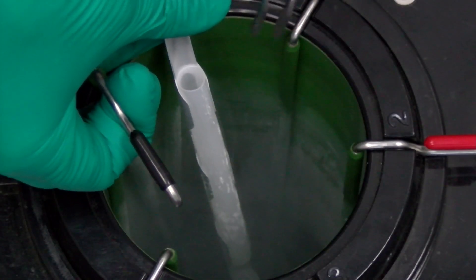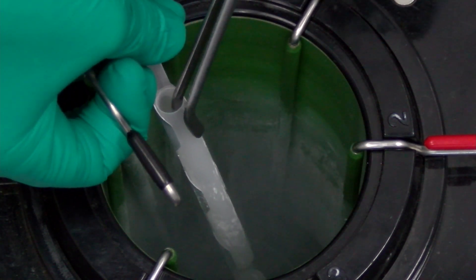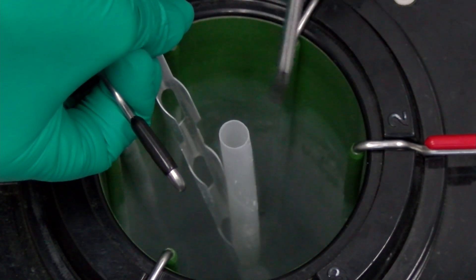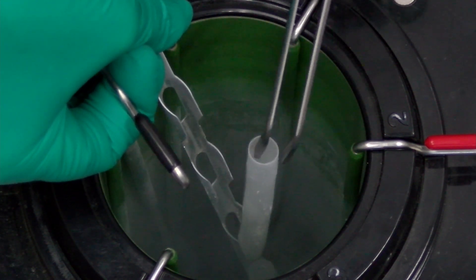When you have used all the straws in the top goblet, remove it with a pair of tweezers. There could be some liquid nitrogen in the goblet, so use care when discarding it. When you have used all of the semen in a cane, discard the empty cane.